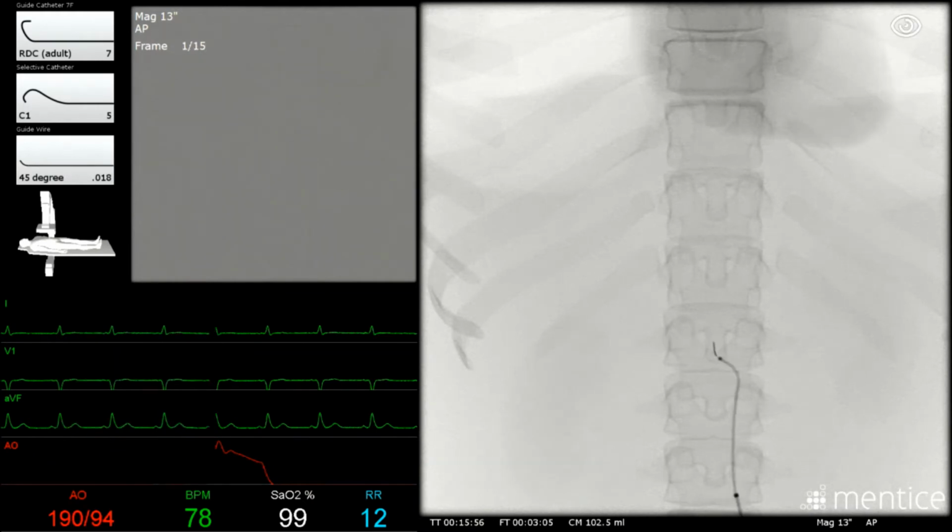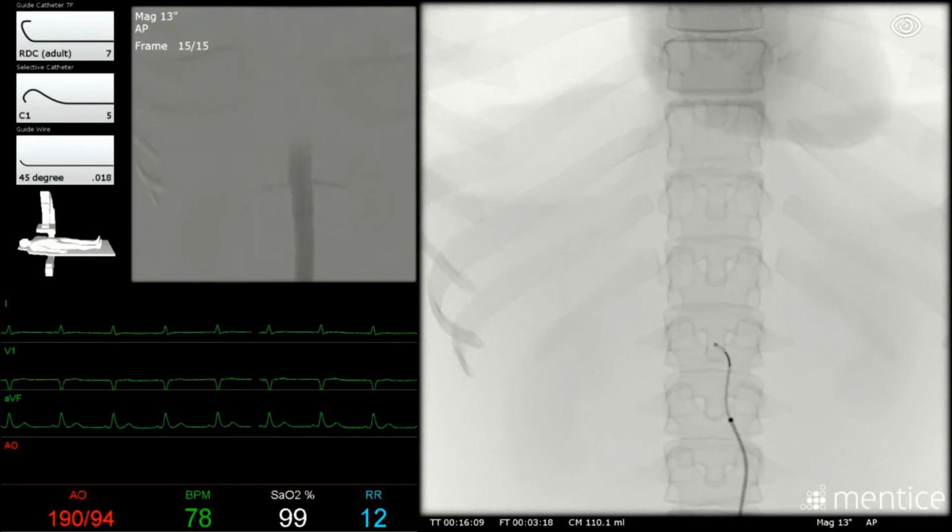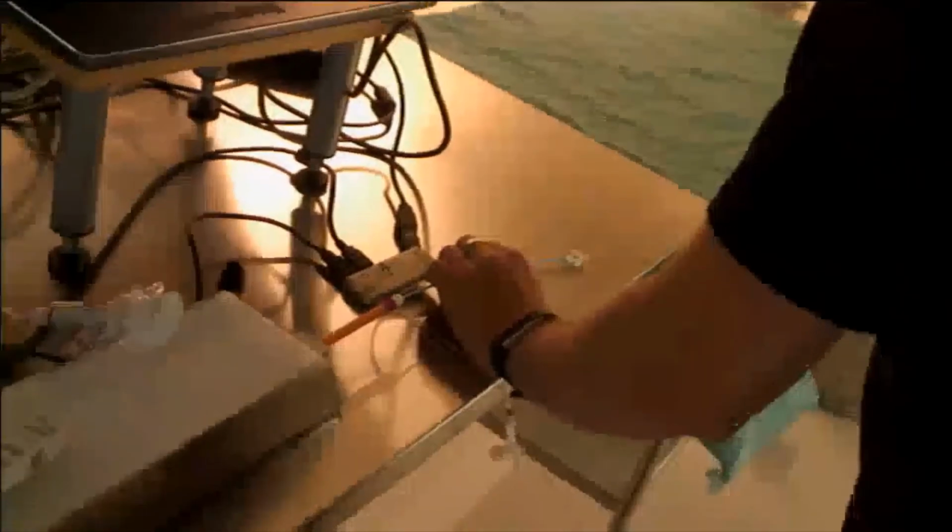You will notice here, when I hit the X-ray pedal for fluoroscopy, that I've lost my position in the ostium of the renal artery. Again, I failed to use fluoroscopy when removing and inserting tools, but I do have an excuse. Just like in real life, these procedures are generally done with an assistant who aids with the manipulation of tools. Today, I'm operating alone, and it's very difficult to be in 2 places at once.